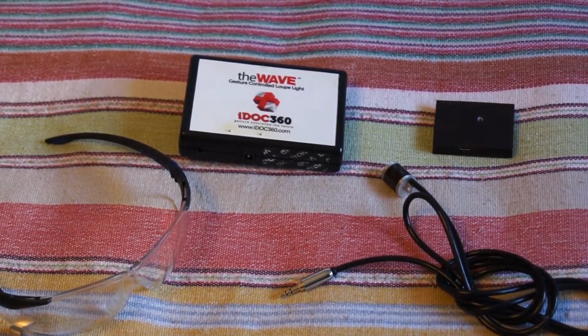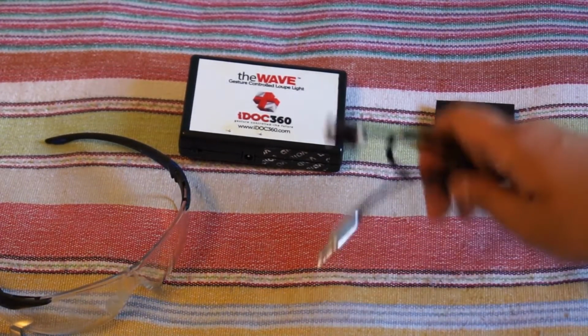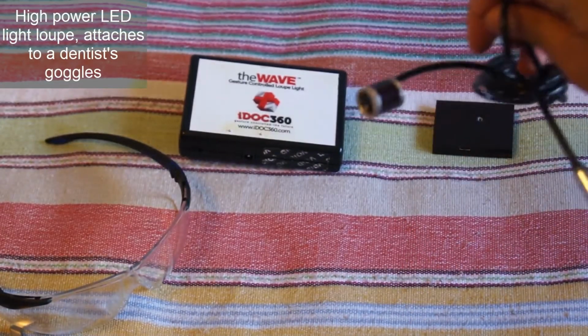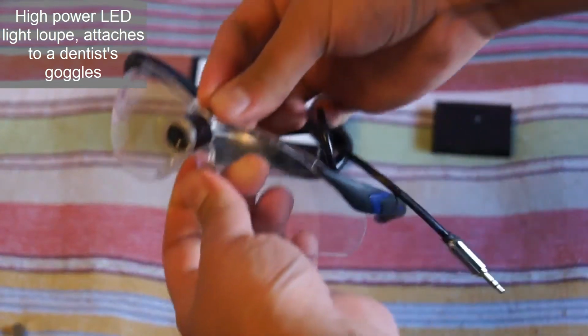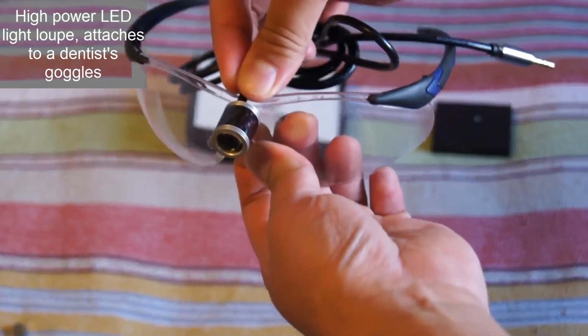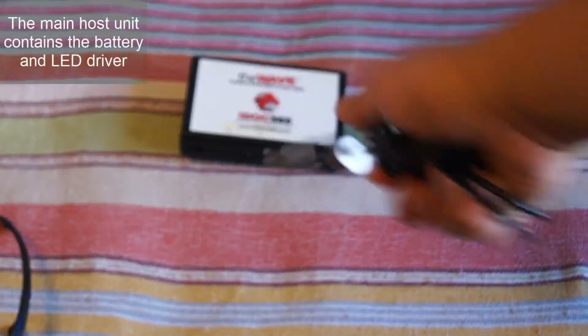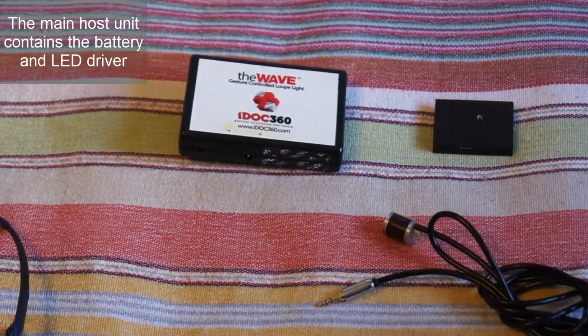This is my project called theWAVE, which I was hired to make for iDOC360. What it is, this kit, is a high-powered LED light loupe, and dentists will have it attached to their goggles like this. This will plug into there, and that is the battery pack and the LED controller, and it'll control the brightness and things.